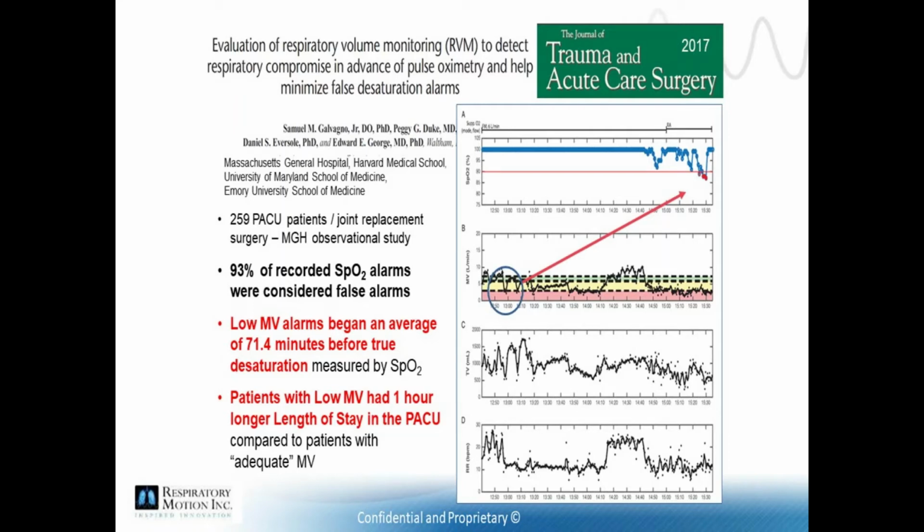Subsequently, patients who experienced low-minute ventilation alarms had a 1-hour increased length of stay in the PACU as compared to patients with adequate minute ventilation throughout their stay.